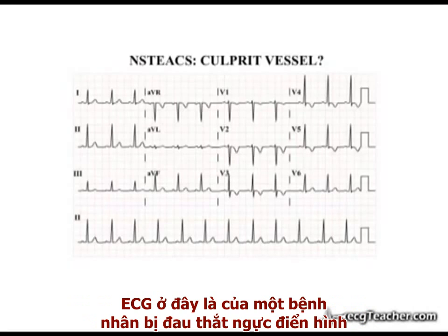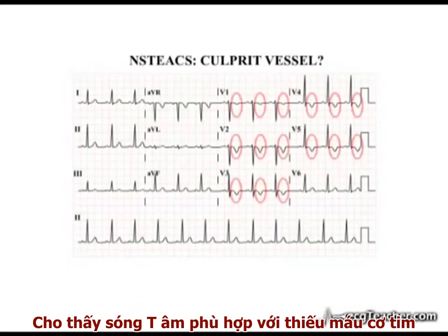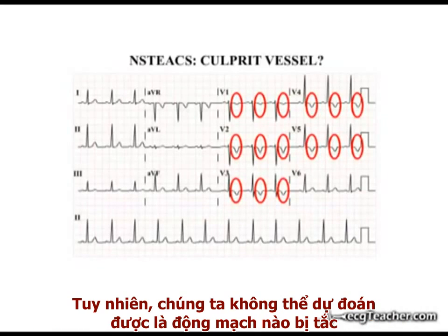The ECG shown here from a patient with typical chest pain demonstrates T wave inversion, which is certainly consistent with myocardial ischemia. However, we cannot deduce which coronary vessel is involved.